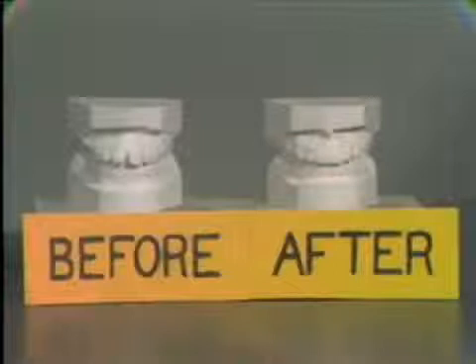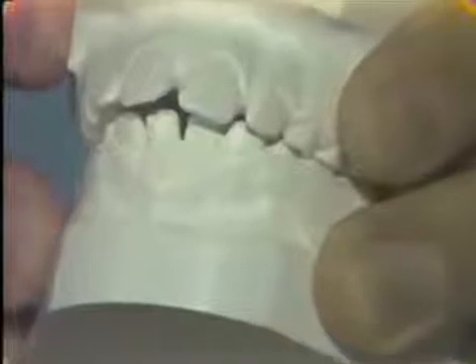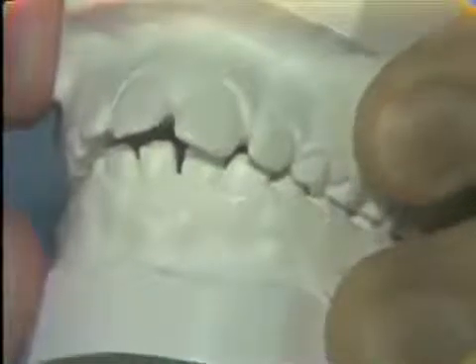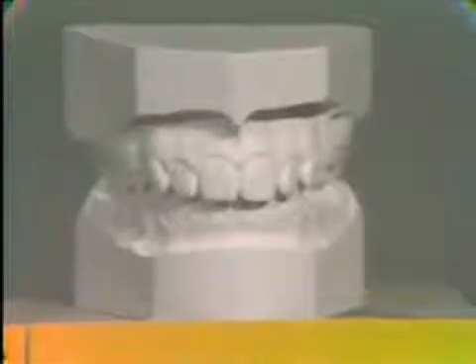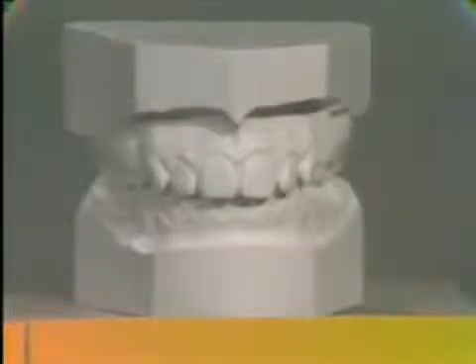The greatest lingual tooth movement effect from the oral shield occurs in habit cases with maxillary incisor spacing and anterior open-bite incisor relationships. These are models of a thumb habit case treated with an oral shield. I'm holding the before-treatment models showing maxillary incisor spacing and incisor open-bite. The oral shield was used for 18 months, worn at night while sleeping. The after-treatment models exhibit a 3mm overjet reduction, closure of the anterior incisor spacing, and establishment of cingulum contact of upper and lower incisor teeth.